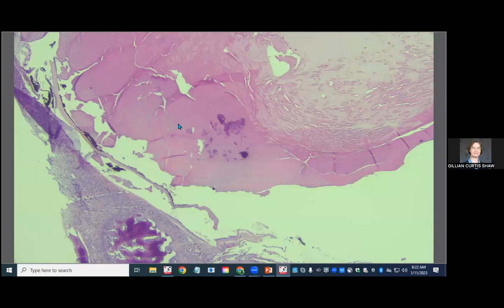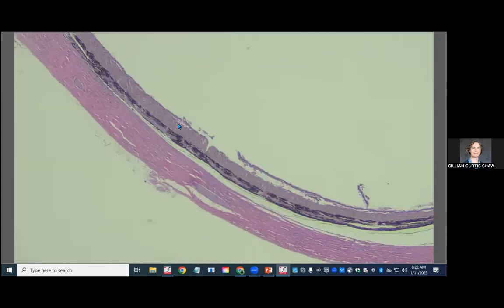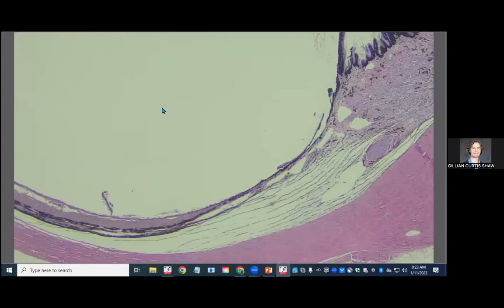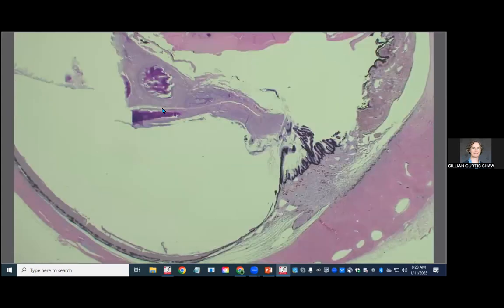And then back up to this area, we've got a cataract. And before we move on from that side too, there's that well-formed tapetum that we can see grossly as well with that green. So here's the tapetum, choroid tapetum from there to there. So overall, this globe had a couple of congenital malformations.